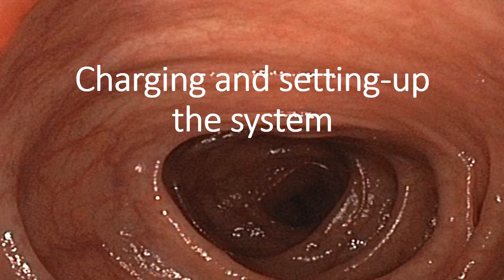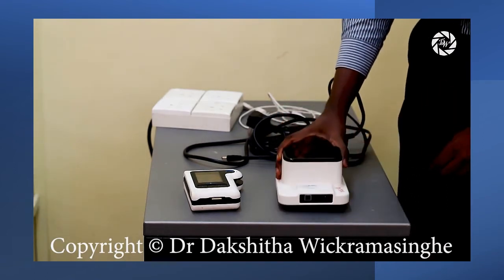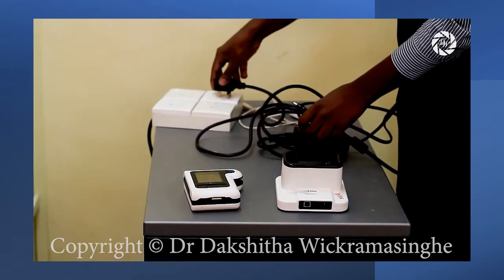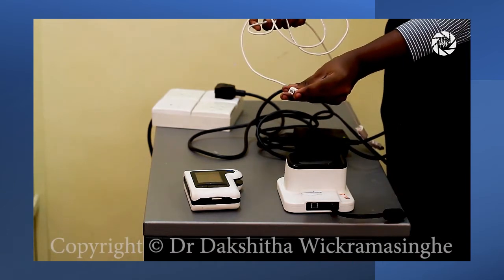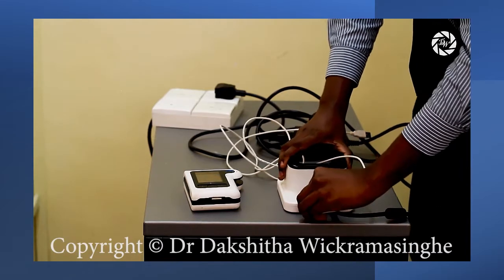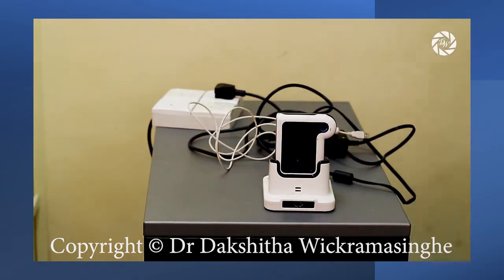Let's see how to charge and set up the system. The cradle has two connectors. First, plug in the power adapter and then connect it to the power connector on the cradle. Next, connect the USB type B connector on to the data port. When the receiver is placed in the cradle, it will automatically turn on.